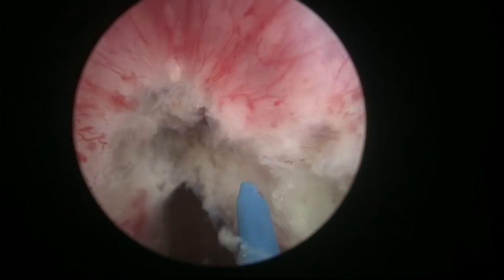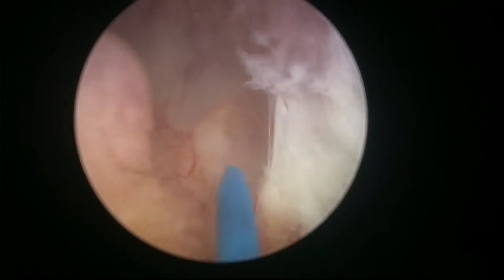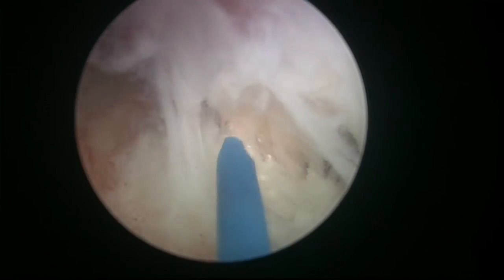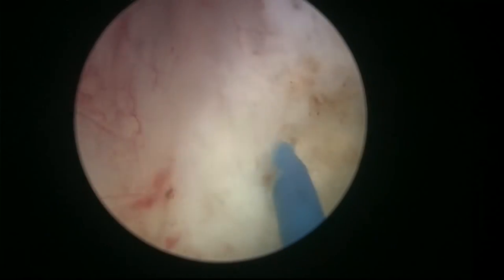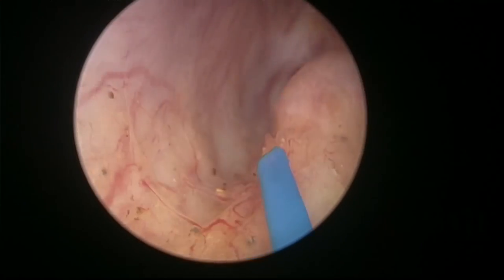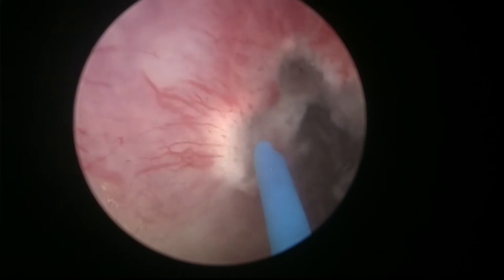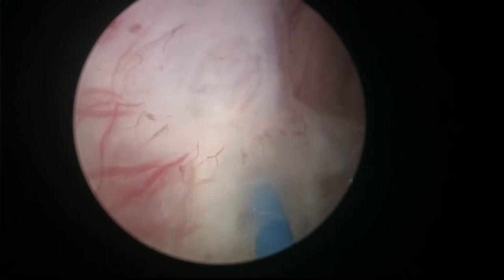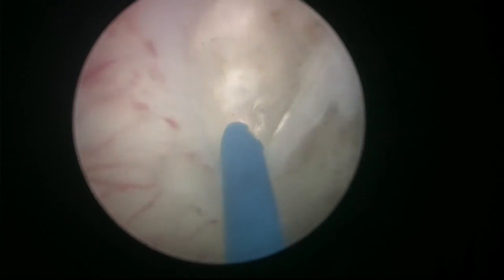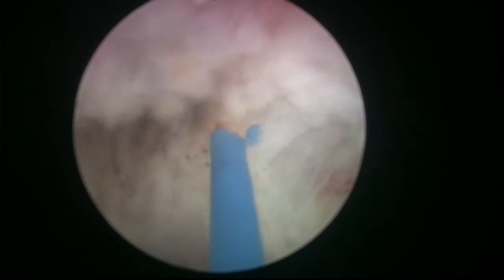Then try to bring the incision downwards more or less following the contour and limits of the sphincter. I don't recommend going very much inside because the plane reaches the sphincter, and if you mark inside it's going to cause problems later. It's nice to mark exactly where the sphincter ends, or one or two millimeters inside, but not more than that — otherwise the mucosa will break where the plane truly is.